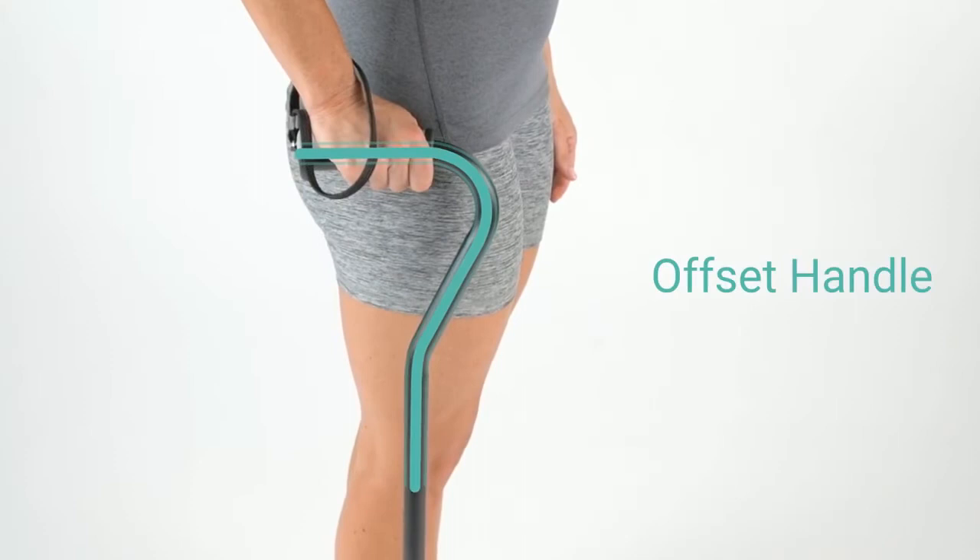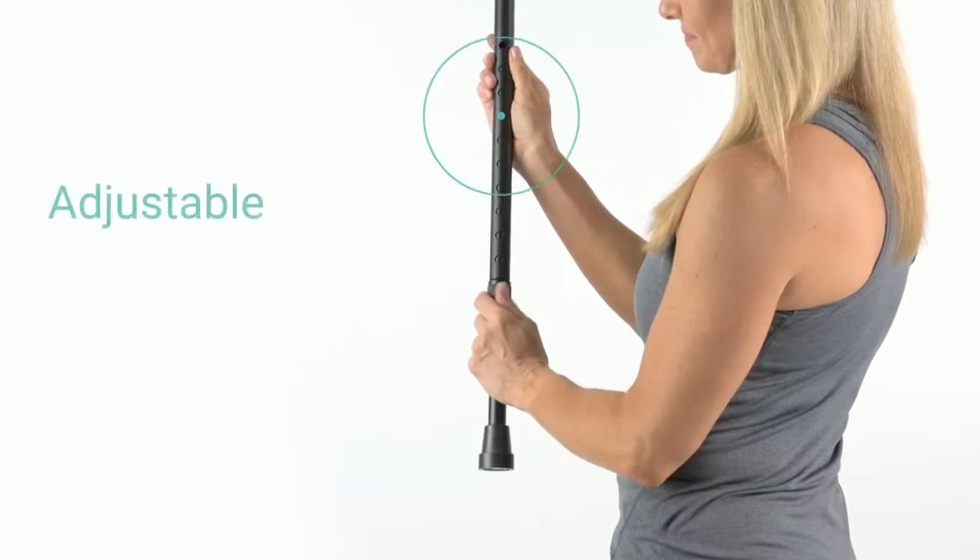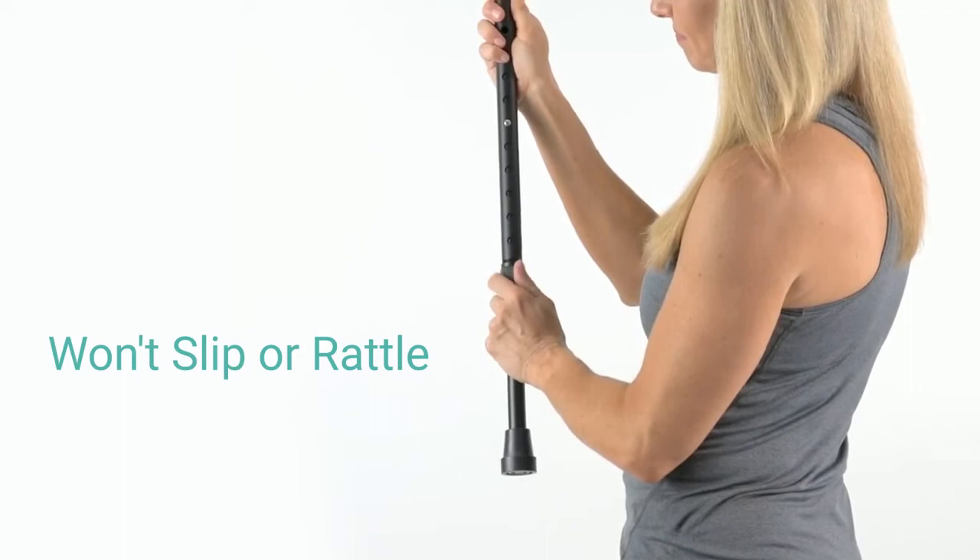The Walking Cane by VIVE provides exceptional mobility and balance assistance. An offset handle centers weight over the base, providing greater stability and support while reducing hand and wrist fatigue. The ergonomically contoured grip offers a comfortable, secure hold. A push-button adjustment pin and locking ring ensure the cane stays at your customized height without slipping or rattling.